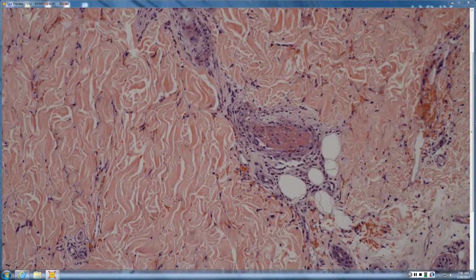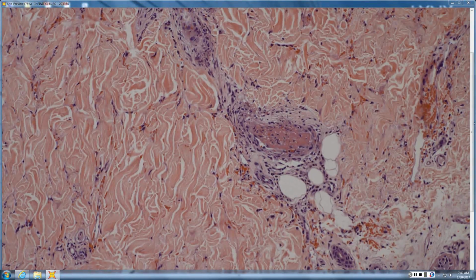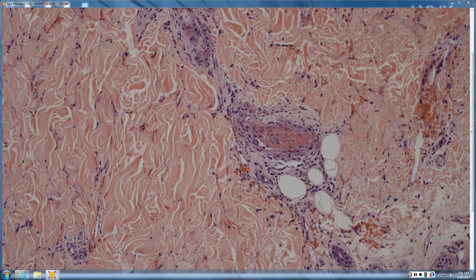vasculitis, and any kind of vasculitis that's superficial and deep, with necrosis of the endothelium, lots of thrombi, kind of dirty thrombi with neutrophilic debris, is characteristic for a septic vasculitis. So vasculitis, if it's post-capillary venule only, then you think of things like Henoch-Schönlein purpura, most connective tissue disease vasculitis, serum sickness, most drug-induced vasculitis.